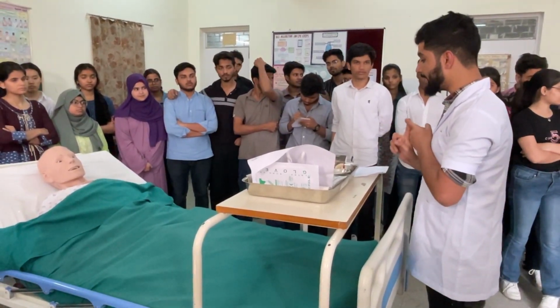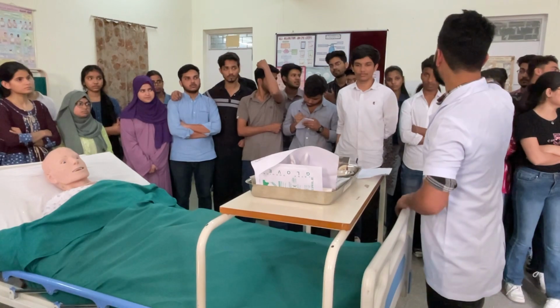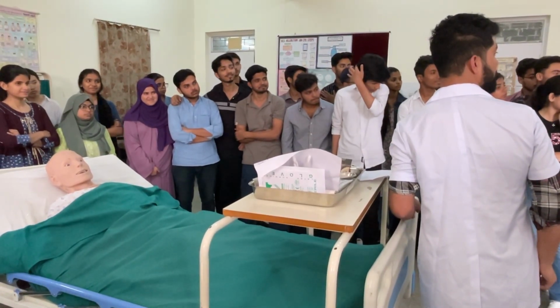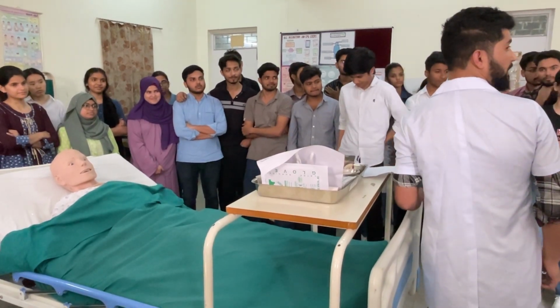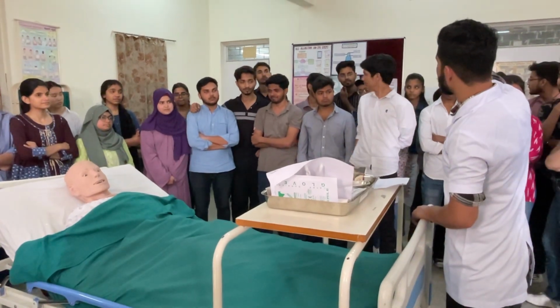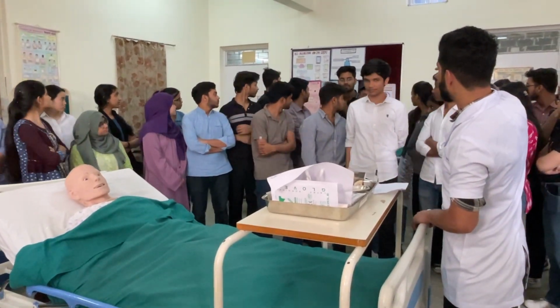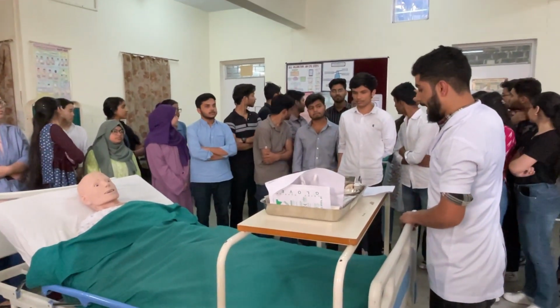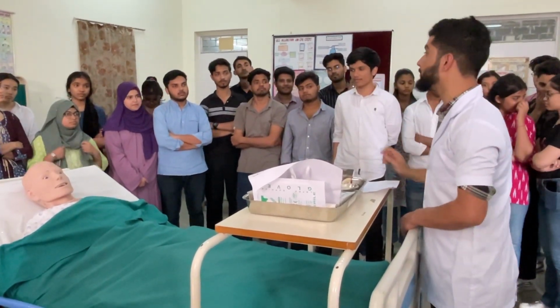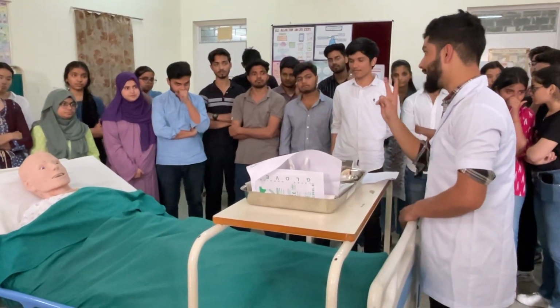The second instruction is the warning sign. Look at the warning sign there: Attention, no smoking. This should be posted behind the bed or on the client's bed. This is the second instruction.